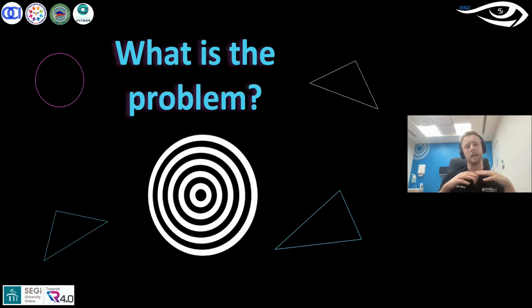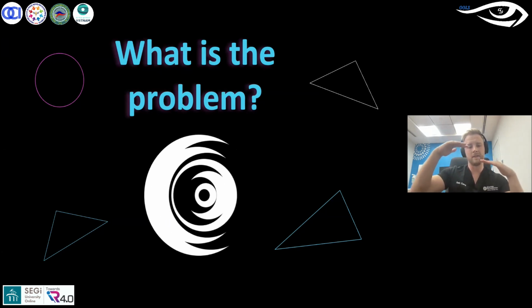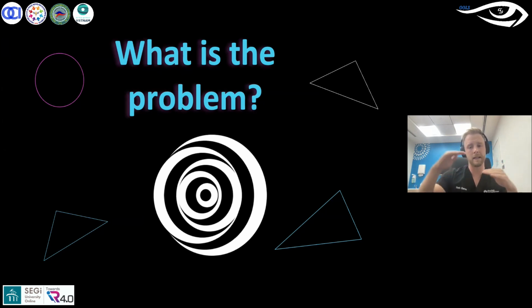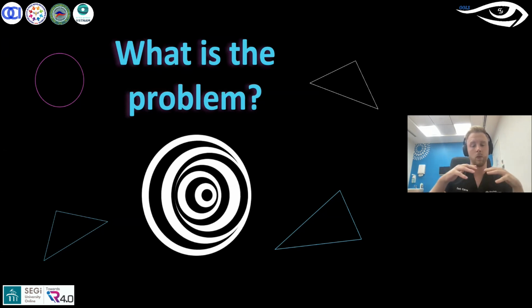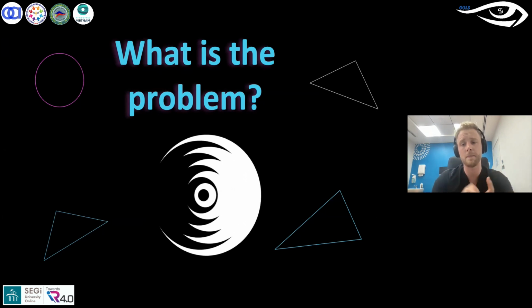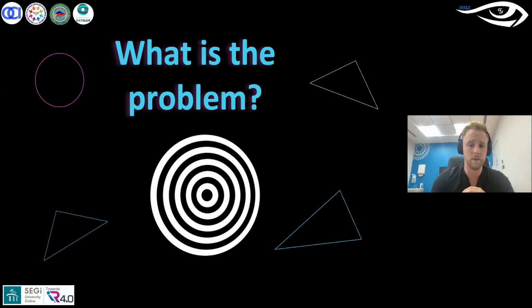I explain this to a patient as if you have a floor, and the floor is at different levels. So you've got high bits and low bits on a floor. It dries at different patches. So the high bits will dry sooner, and the low bits, obviously, that's where the lubricating drop or the tears will pool. So we want to make sure that these patients are lubricating, just so that we can get some type of stability in the refraction.